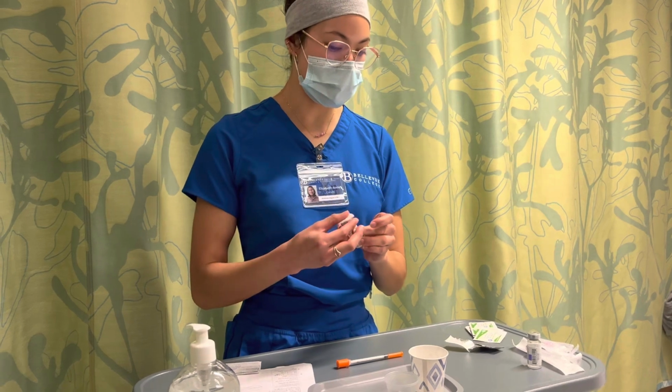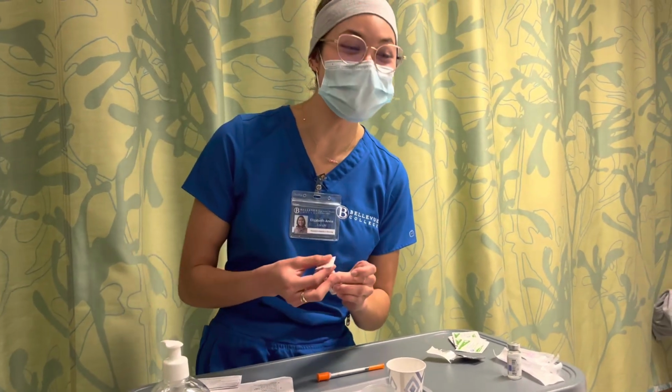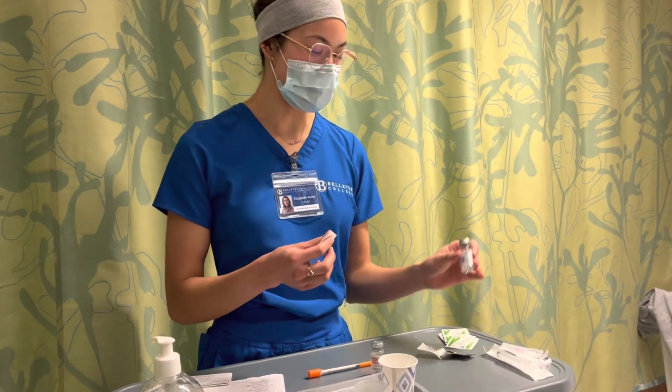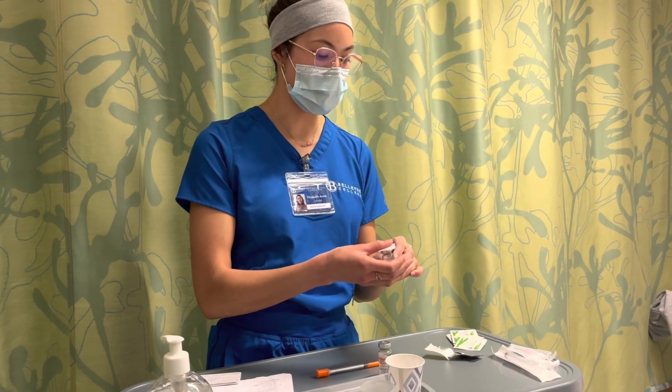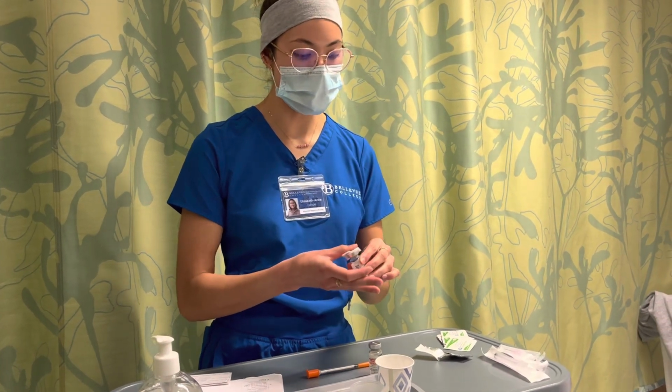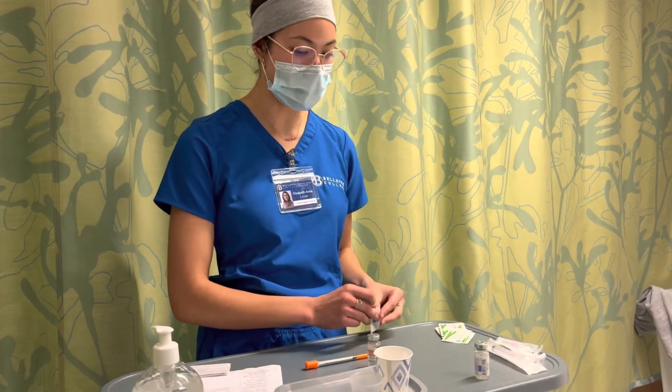So I'm going to clean the top of these for 30 seconds for the sake of time. Clean this one as well for 30 seconds and allow them to dry completely.